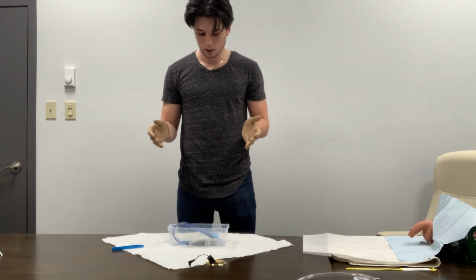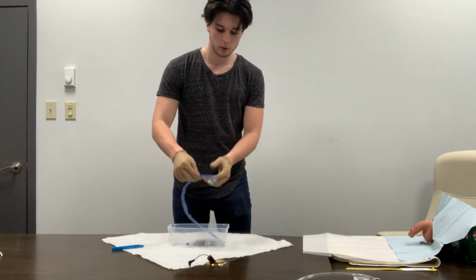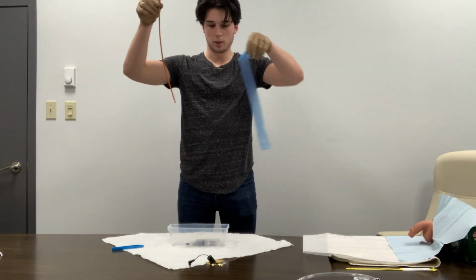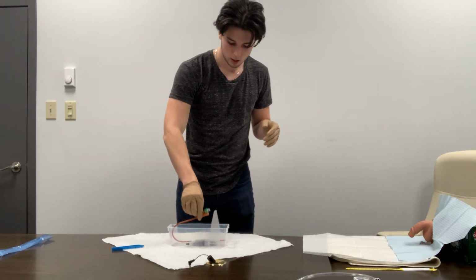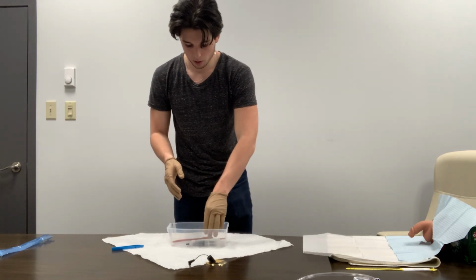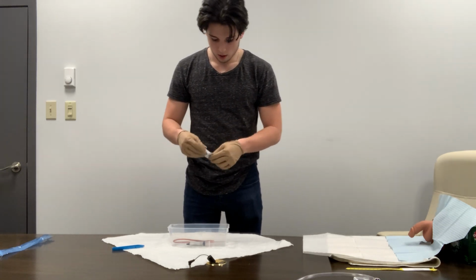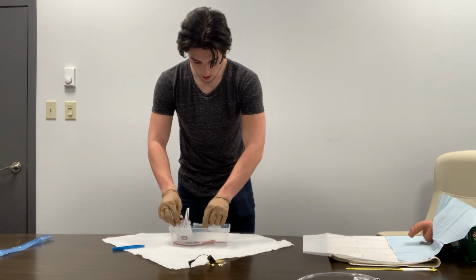So now we are working in our space, and we're able to touch everything inside of here because our gloves are sterile. So we can grab our catheter here and pull this out, and we can throw this away, and we can put our catheter inside of our boat. So once this is inside, then we'll grab our povidone sticks inside, and we'll open them and get them ready for later use.